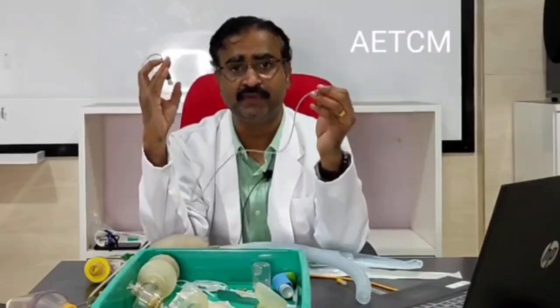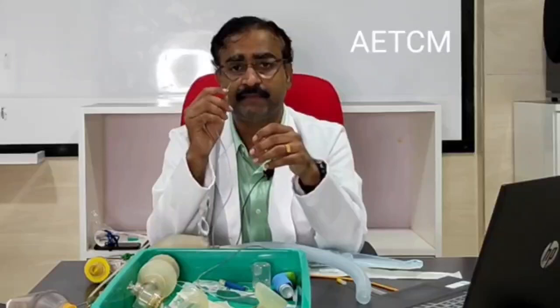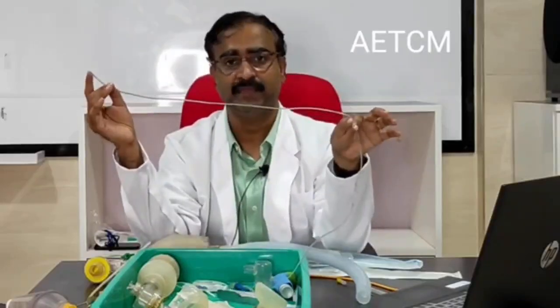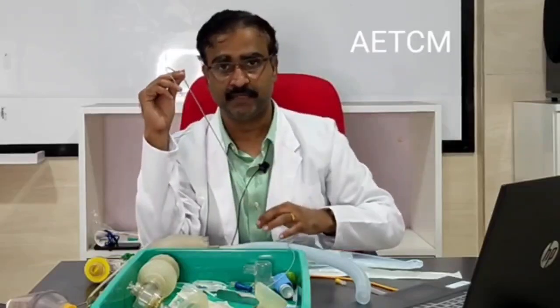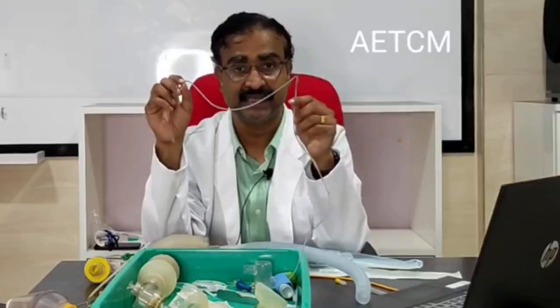Now, how do you use this? How do you insert? How much? See, look at the tube. The tube is very, very long. So how do you insert? What we do is we measure it from the ala nasi right up to the tragus of the ear, and from the tragus of the ear up to the xiphisternum. This much would be the length for me. Okay. So once again, from the tip of the tube which is kept at the ala nasi to the tragus of the ear, and from the tragus of the ear up to the xiphisternum in a continuation. That would be the amount that would be inserted inside the nose, through the nose into the stomach.